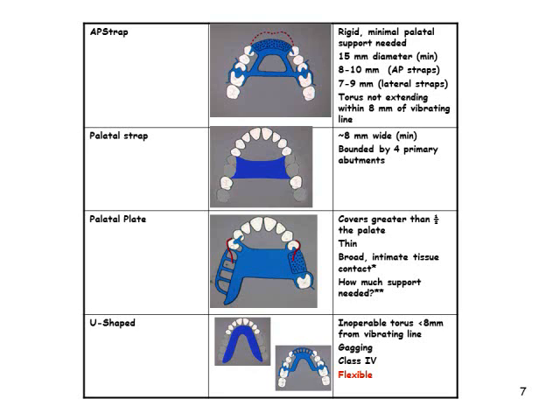In a long edentulous span Class III, modification 1 arch. In Class IV arches. And when there is an inoperable palatal torus, which does not extend to the vibrating line. The anterior-posterior palatal strap is parallelogram-shaped and open in the center portion. It has relatively narrow 8 to 10 mm anterior and posterior palatal straps.